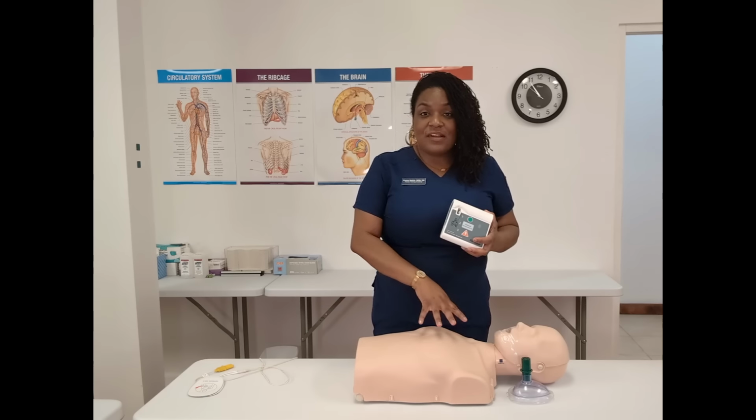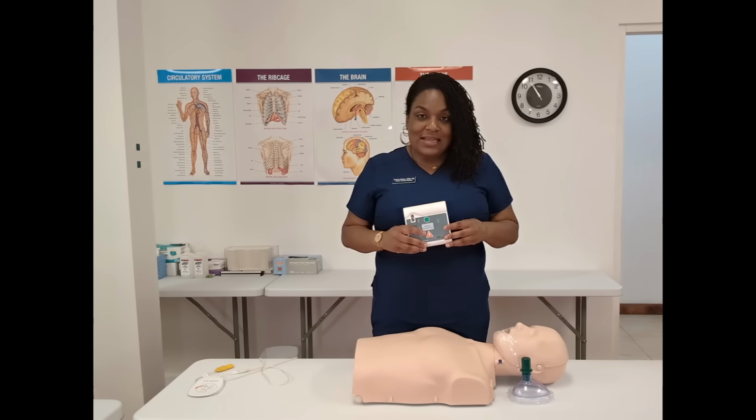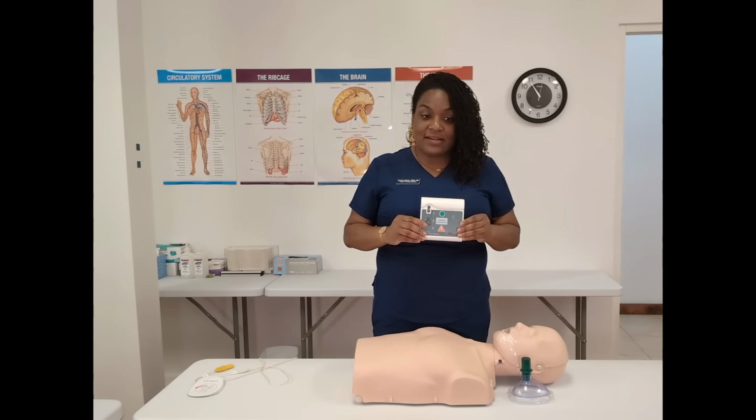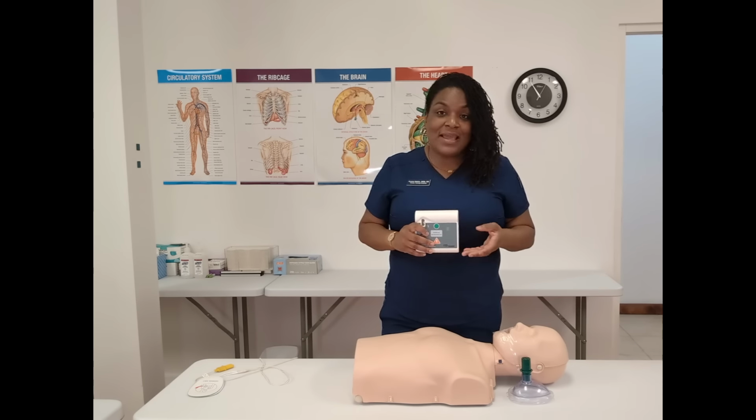At this point, if someone's in cardiac arrest, don't overthink it. Yes, you can use the AED if somebody has an implanted device. You just cannot place the pads on top of that implanted device. If that device was doing what it was supposed to be doing, it would be shocking the person in cardiac arrest if the person required a shock. And so the first thing you do when the AED arrives to the scene is you're going to power it on. Once you've powered it on, you want to follow the prompts.